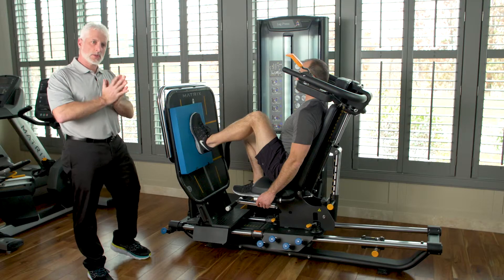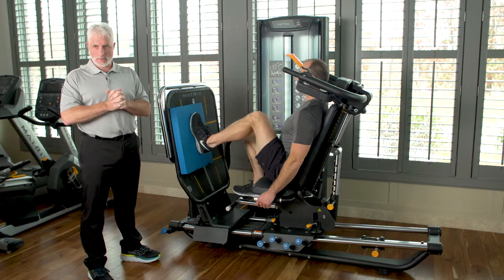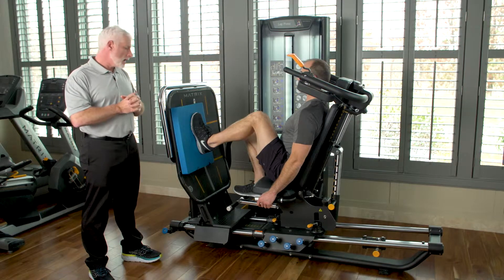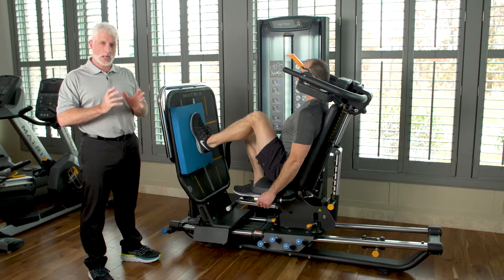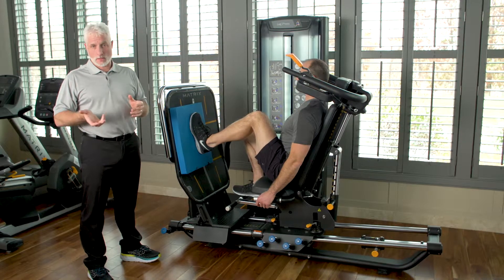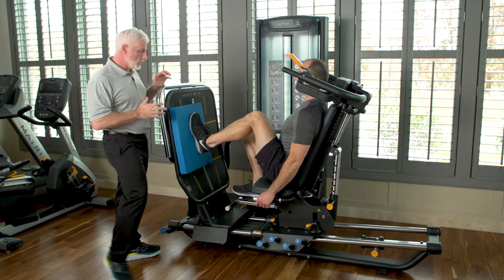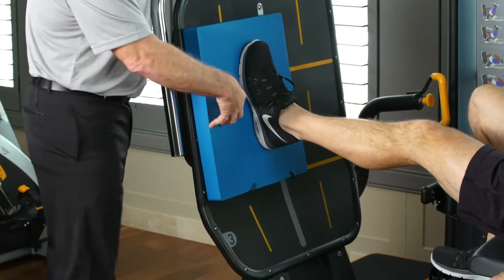Here we're going to demonstrate a patient that has an ankle sprain — a higher mid-level — and the anterior talofibular ligament is usually involved. As therapists, with this leg press you can do different types of activities where you can challenge the ankle muscles, work on proprioception and balance. What we're going to show is: as we push backwards on the leg press, we have foam which is going to cause the ankle to move and change.